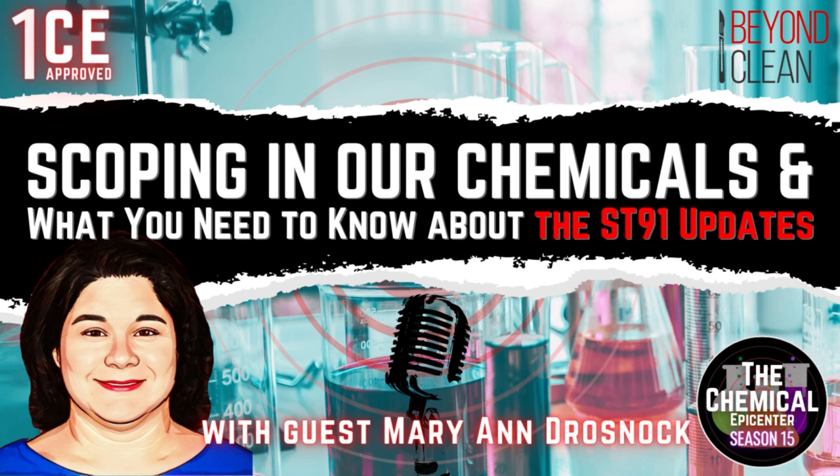Well, I think that's a great question. And although it may seem obvious to a lot of people, I think it's worth the explanation that flexible endoscopes and other types of scopes, rigid scopes in particular, or other stainless steel instruments, they're different, right? They can't be subjected to the same type of chemicals. They can't necessarily go through the same kinds of sterilization processes because they're fragile. They're much more susceptible to damage. They have coatings on them and adhesives that can wear away with exposure to those different oxidative chemistries and heat.